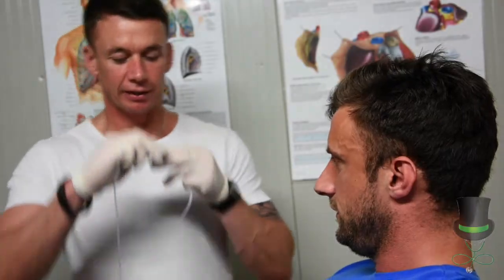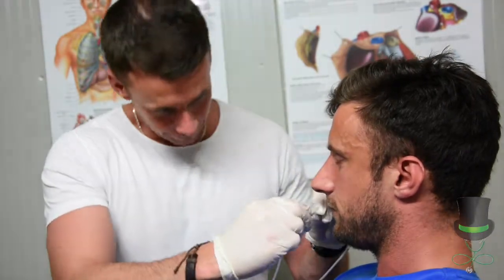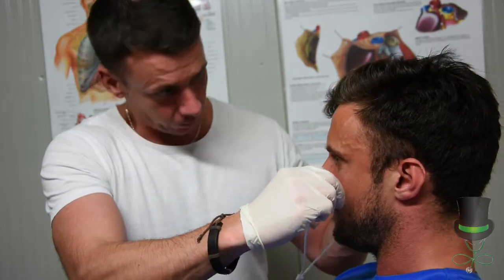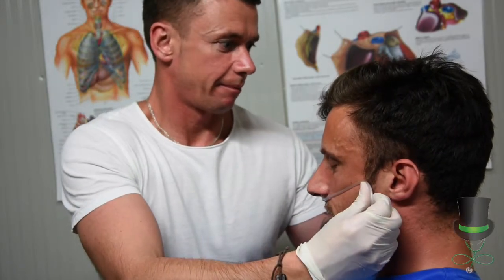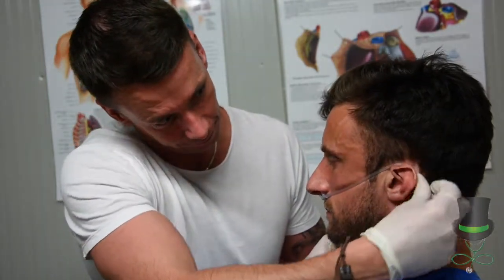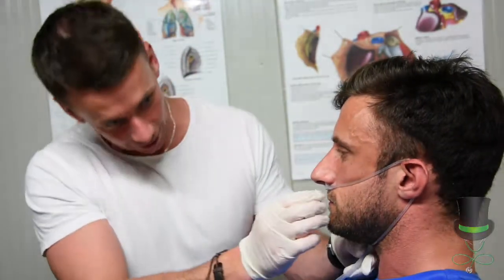After attaching the nasal cannula to the oxygen, we then place the nasal prongs into the patient's nose. We wrap the nasal cannula around either ear and tighten it if we need to at the bottom.